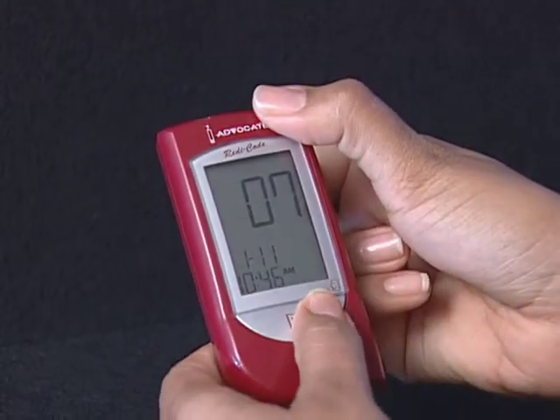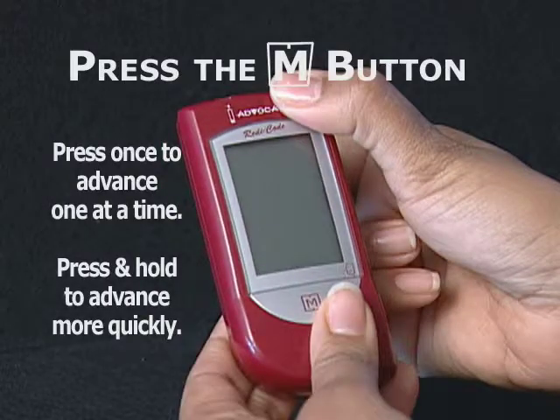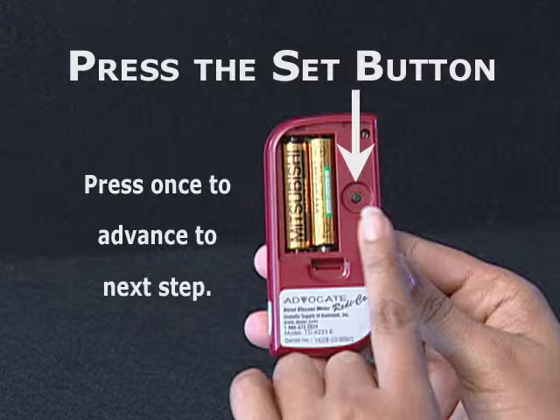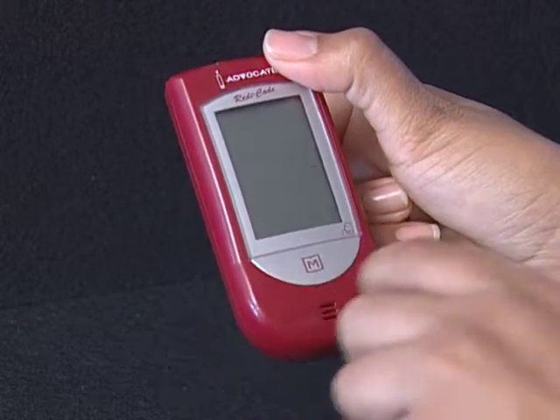Set the minutes. Press and release the M button to advance one minute. To move faster, hold the M button down. With the correct minute on display, press the Set button and then the current unit of measurement starts flashing.